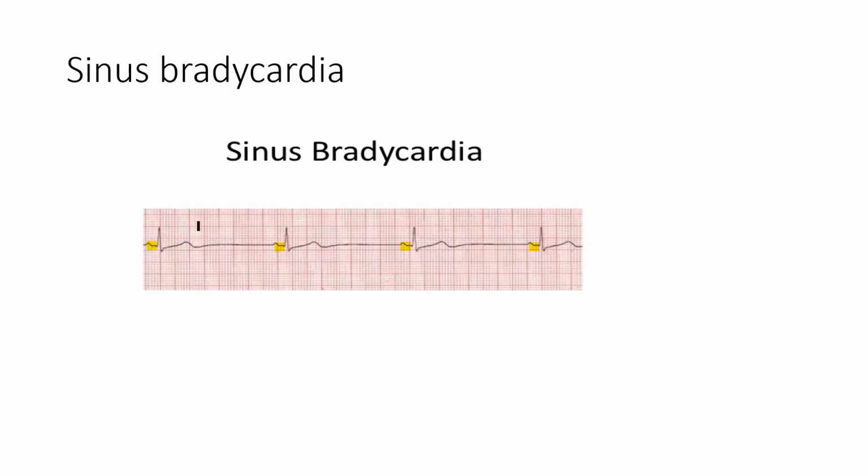And that can be normal, guys. It can be somebody that's athletic. They could be on a beta blocker to help with their heart rate and their blood pressure. There's a number of reasons why people are in sinus bradycardia. But again, it comes down to, are they symptomatic? If they are not symptomatic, then it is not worrisome, okay? And that is it for that. You guys are doing amazing at this.